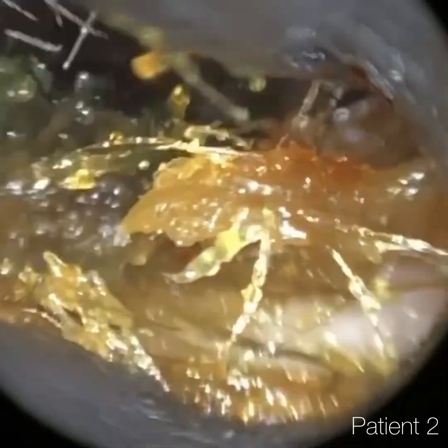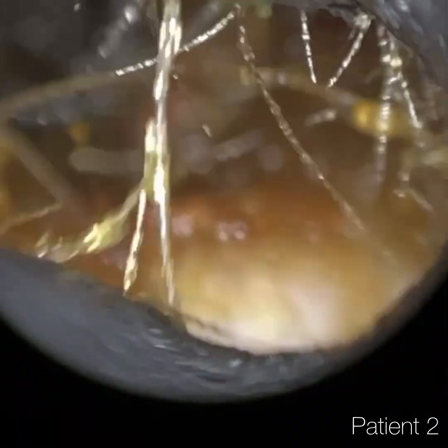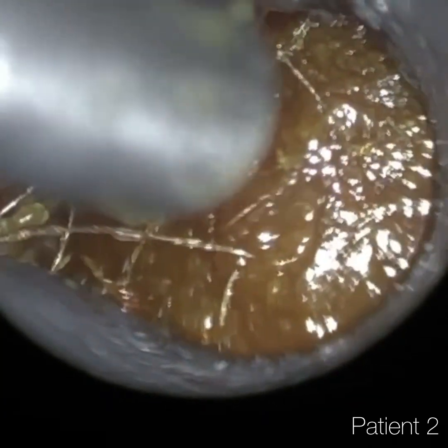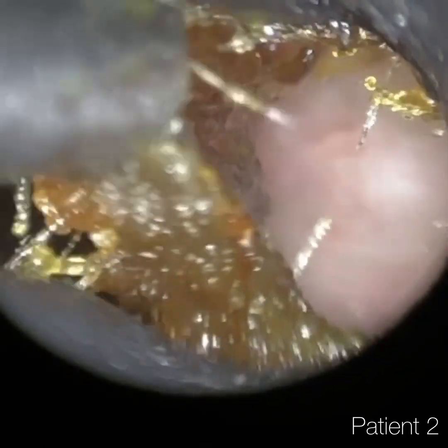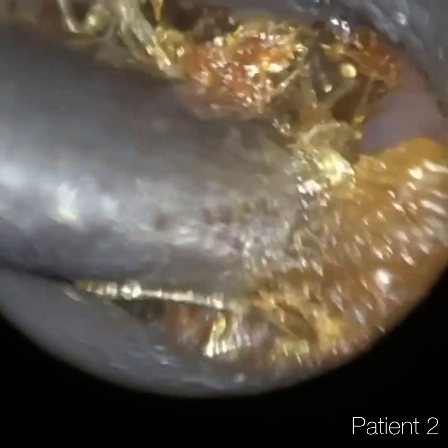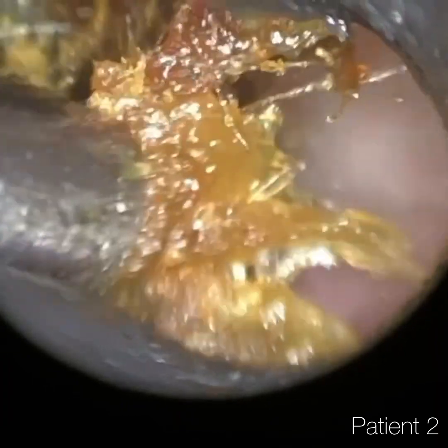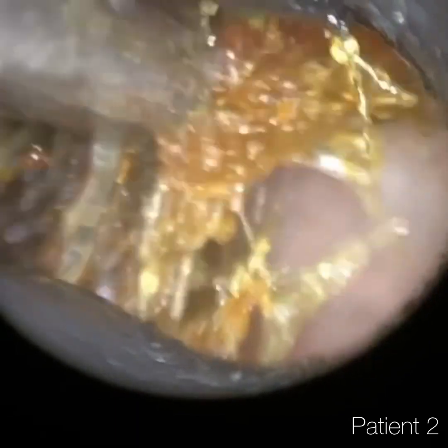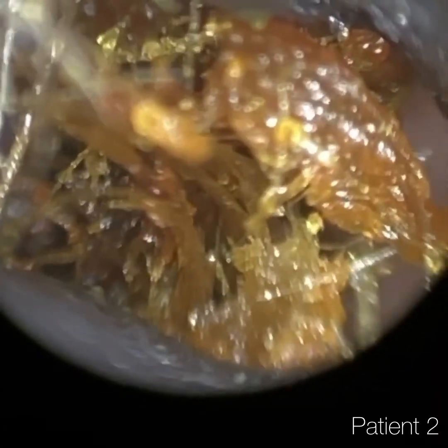The reason why I said it would become more apparent in patient two, if you weren't sure whether it was female or male, is that typically — not always the case, but typically in my experience — men have more hairs not only at the entrance of the ear canal but also on the tragus. The tragus is the triangular piece of cartilage just on the outside part of your ear. A lot of men trim that, and what can sometimes happen is that as they're trimming their tragal hairs, these hairs fly loose into the ear and mat against the wax, which makes it a lot more difficult to remove. So it forms a matrix almost, and the wax gets tangled up in between.